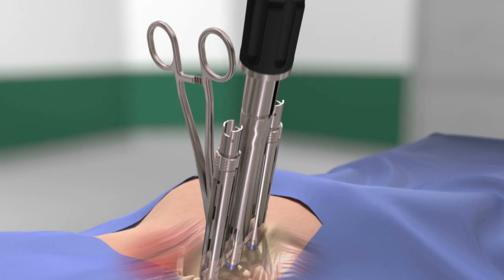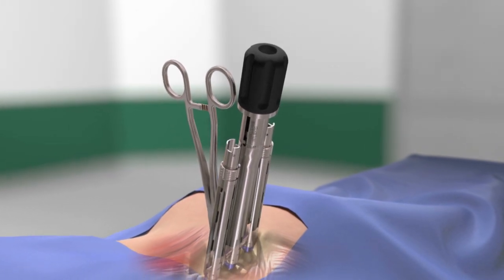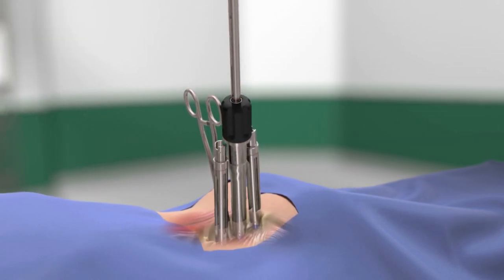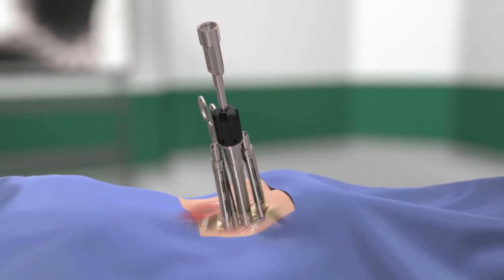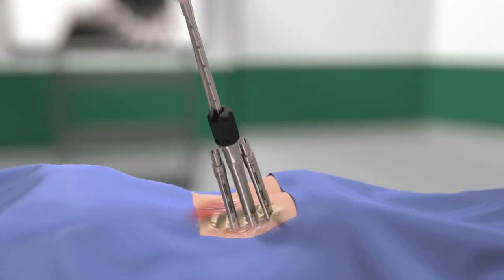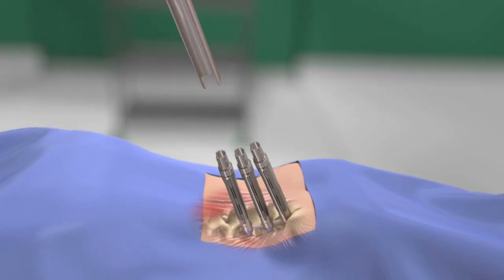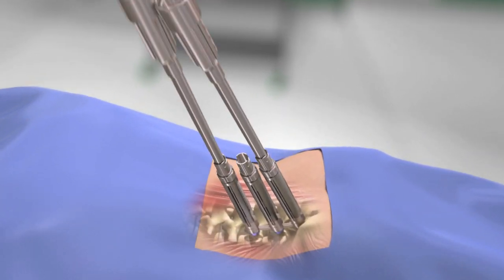Rod reduction can now be performed if necessary. With the rod in place, set screws are now advanced through the screw extensions or rod reducer if being used. After all set screws are in place, final tightening will occur.